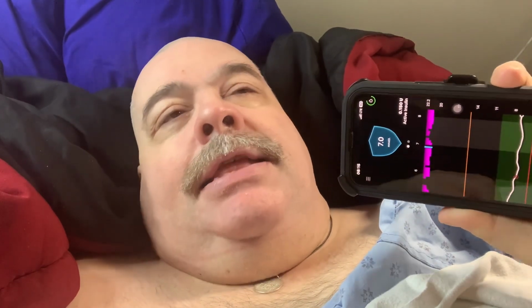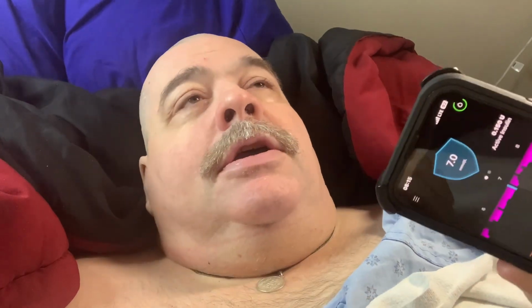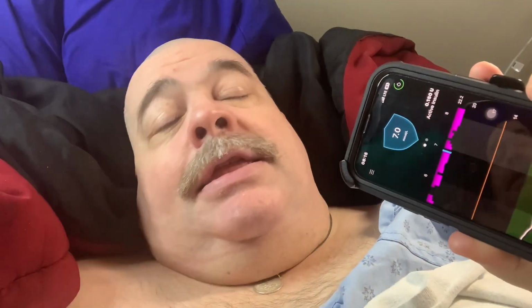Now, the next point is something that I know Dexcom and Medtronic are working on, and that is getting sensors that don't require that much calibration. But right now, most of the time, you have to calibrate. And that means doing a blood test the old-fashioned way with a finger poke. You have to make sure that you're doing your blood test correctly, because if you throw your calibration off completely, the numbers aren't going to work. It'll be a big pain.